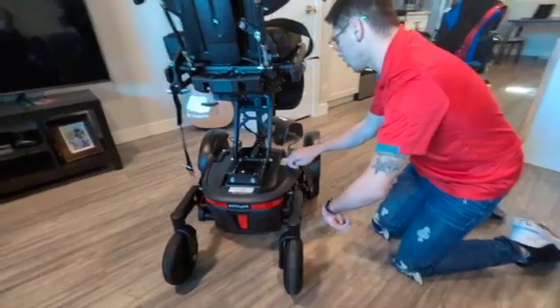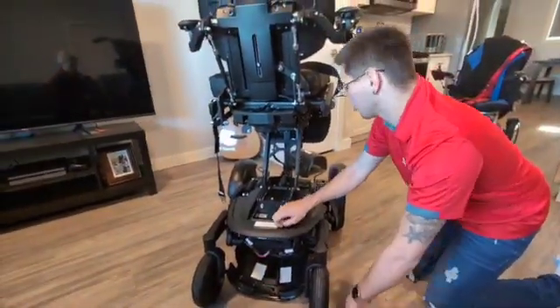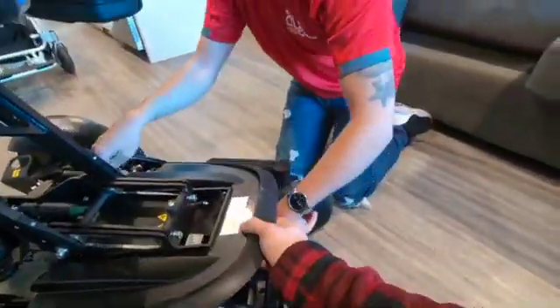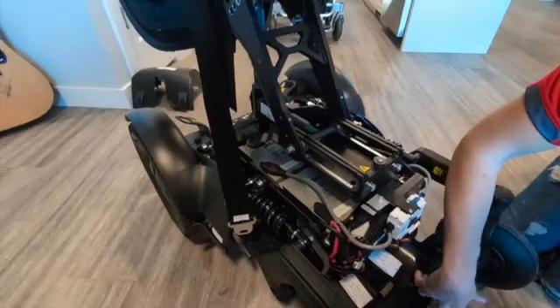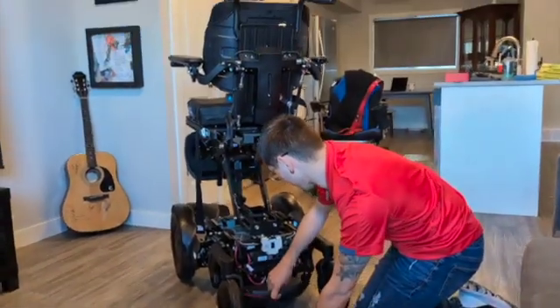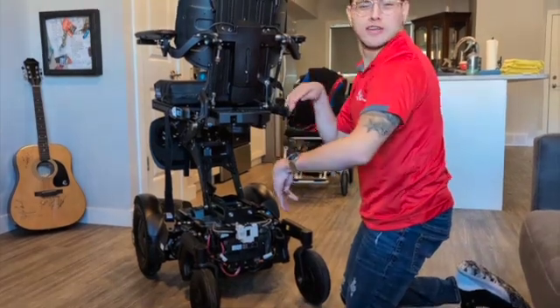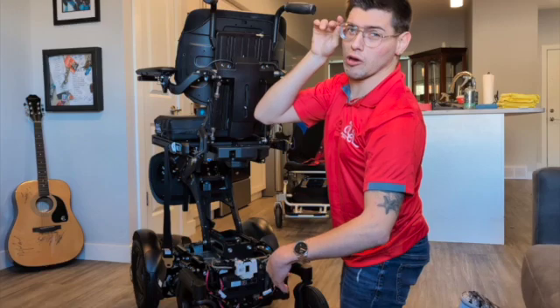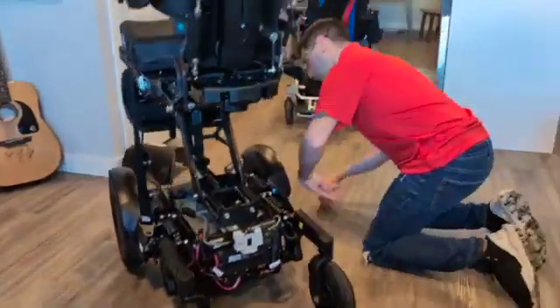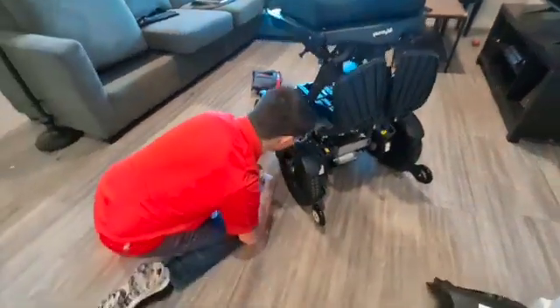Now I think this one will come on. Yeah, perfect. There we go. Okay, I got it unhooked finally, so I can just slide it out like that and put that there. I'm not going to take off the fenders because I'm pretty sure you have to take off the wheels to do that, and I think I can do it without. So we will see. But I know for a fact that the center cap comes off the wheel like that.